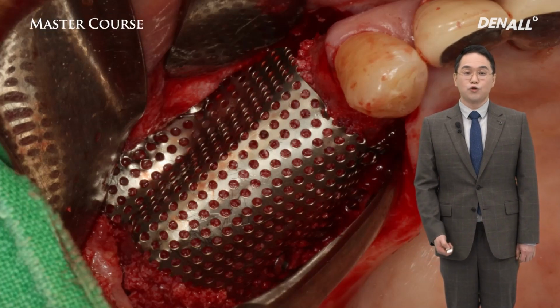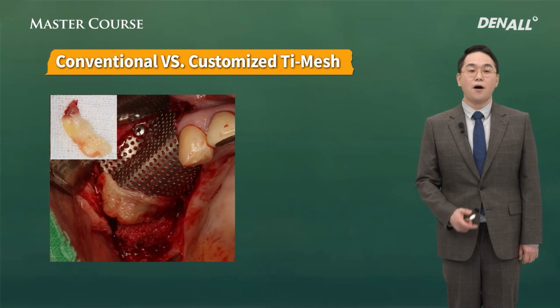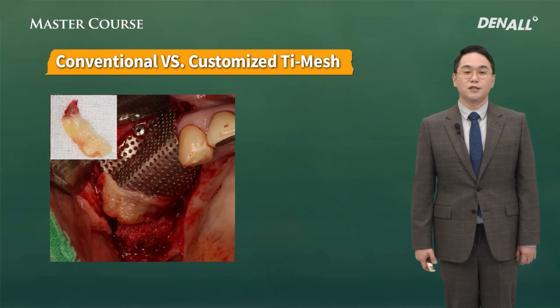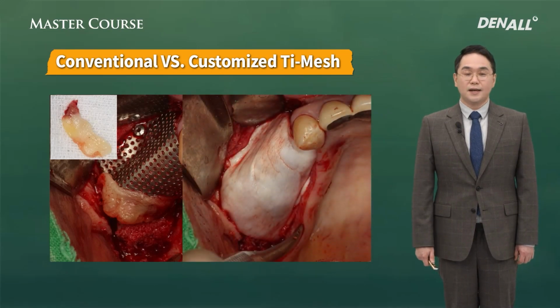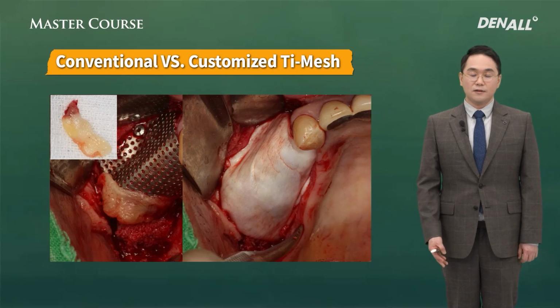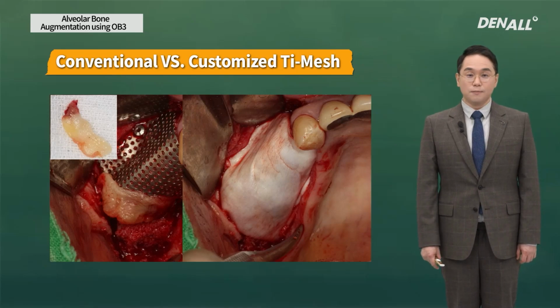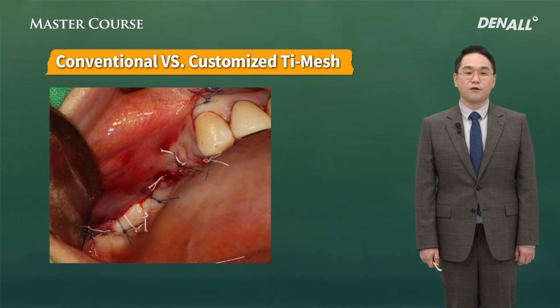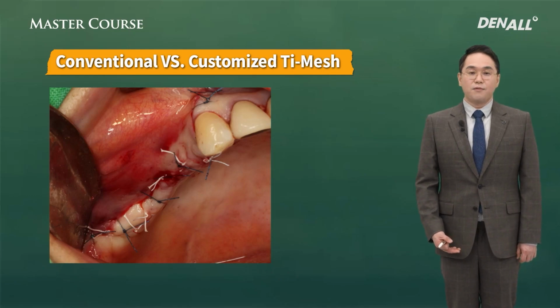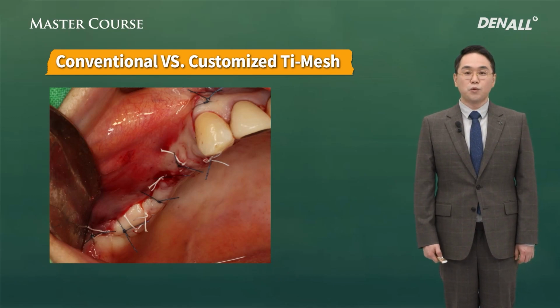The disadvantage of titanium mesh is exposure. To minimize it, we need to draw blood from a patient to make a PRF to cover the edges where exposure is a concern, and the entire titanium mesh is covered with the OS-guide, the collagen membrane, so everything is covered. The purpose of it is to prevent the exposure, and the buccally releasing incision is made for the flap, and the primary closure is achieved, which is important for GBR as well as the bone augmentation using titanium mesh.